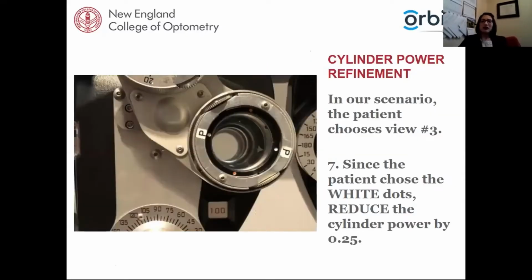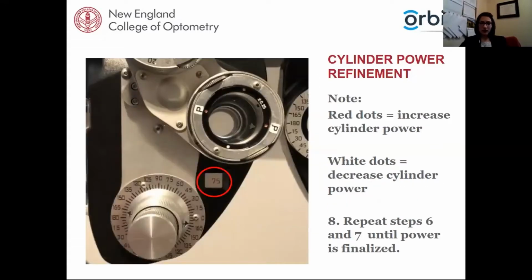And so if our patient chooses number 3, it means that they chose the white dots. And when the patient chooses the white, that means you want to decrease the power. If they choose the red dots, you want to increase the cylinder power. So in our example, they chose the white, so you would want to decrease the cylinder power, and we always go in quarter diopter steps. So in this case, we'll decrease the cylinder power from 1 diopter to 0.75.